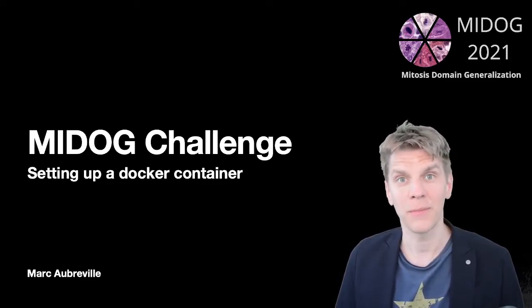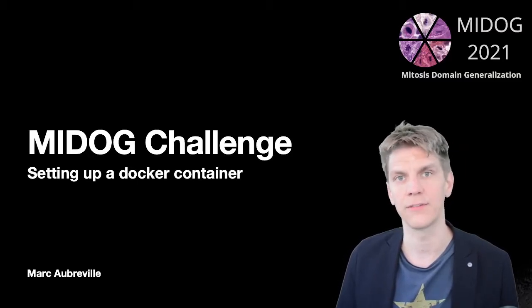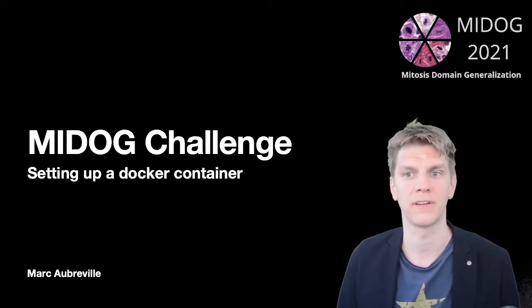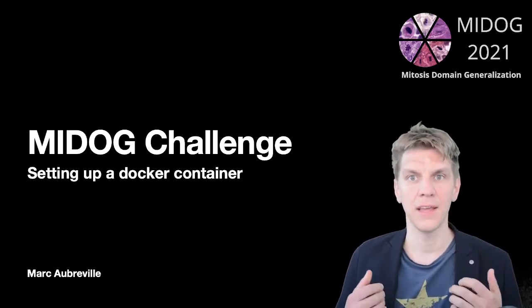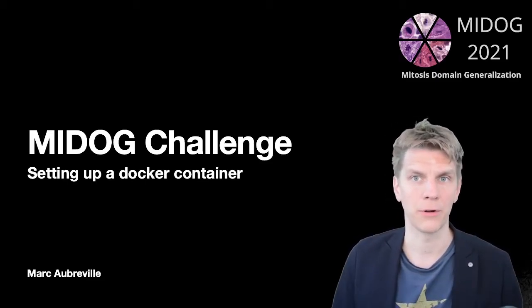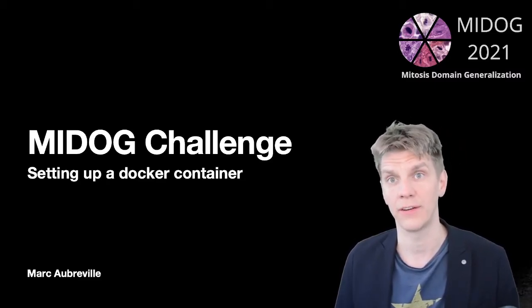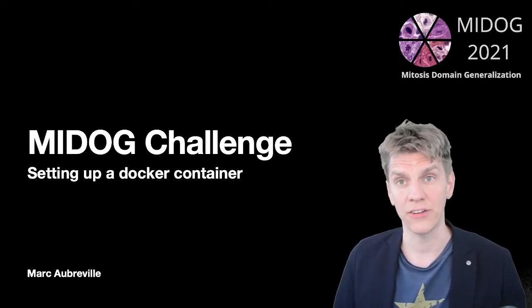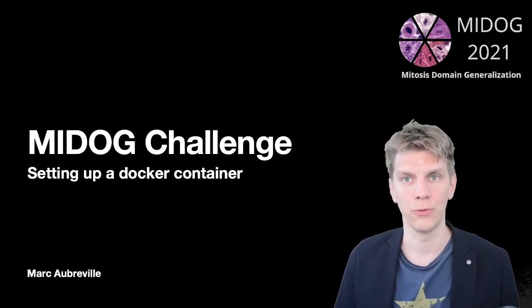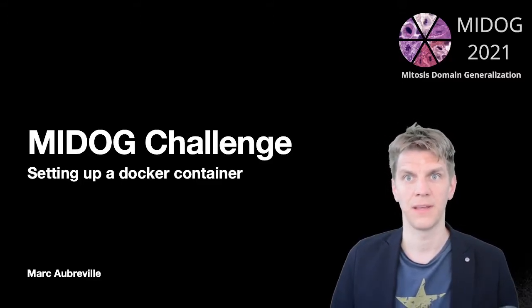Now, as you might know, the challenge target is to detect mitotic figures regardless of the scanner, which is why we call it mitosis domain generalization. In this small video, I want to showcase to you how to set up your Docker container to then submit it to the challenge. We use grandchallenge.org in order to make the whole evaluation process automatic.